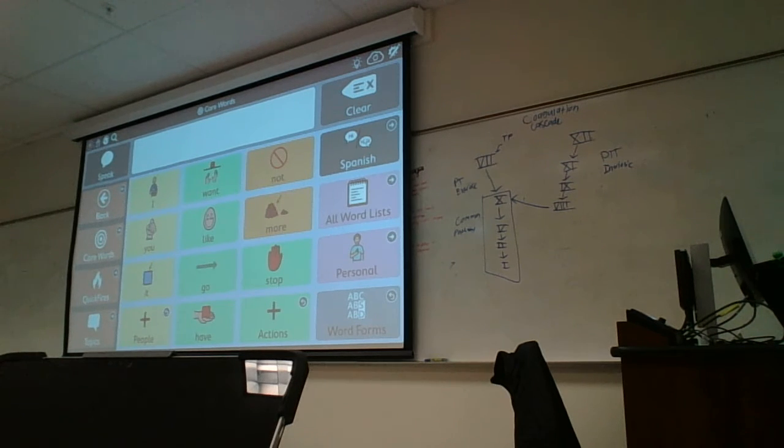This is what I was talking about for a bilingual user. So this button will be here, and it changes the vocabulary to be in Spanish. So it's the same vocabulary, but it just gets mirrored and changed into Spanish language. There's also a language-specific voice option within here, so that you have a boy's voice for the English page sets, but then also a Spanish boy's voice for the Spanish page sets, so it doesn't sound like me trying to talk Spanish. It has this voice specific, so the pronunciations are better, so you can make those choices.